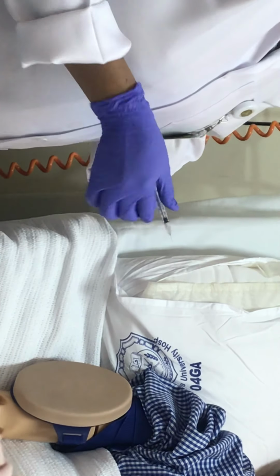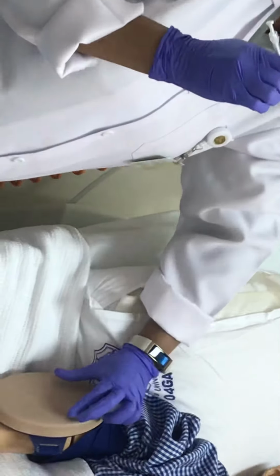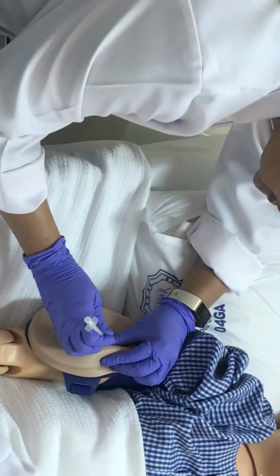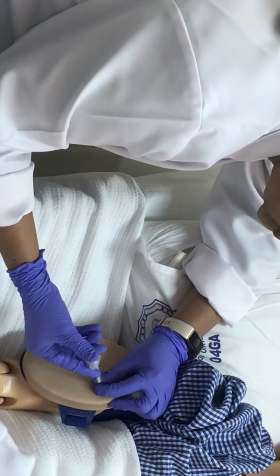Okay, now if I want to give at 90, see how I am holding. The pen. This is the pen method, easy. Okay, like a pen. I think some other ways are very hard. Okay, hold like this, pinch like this, go in at 90, hold the syringe, just give it.